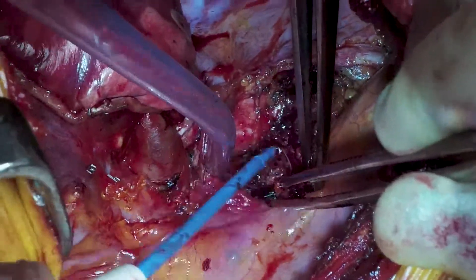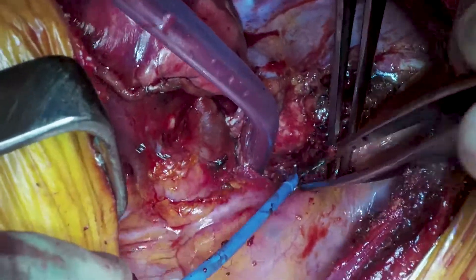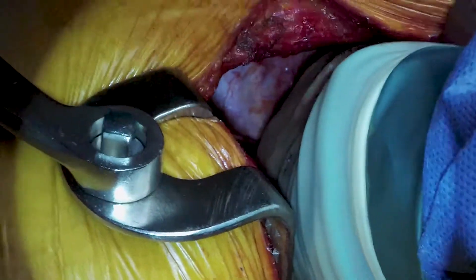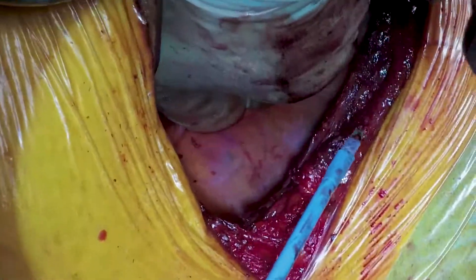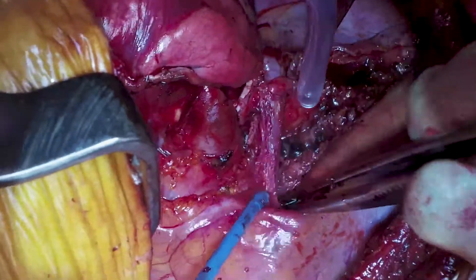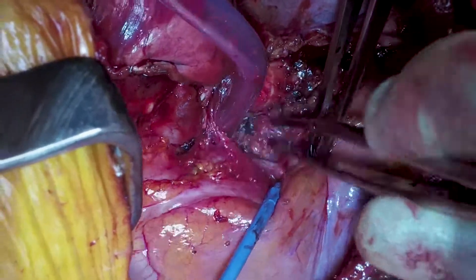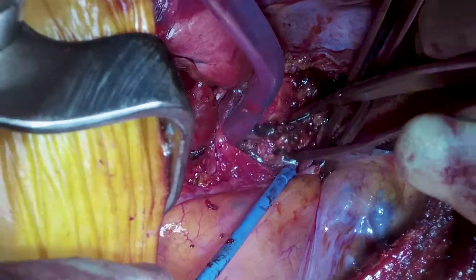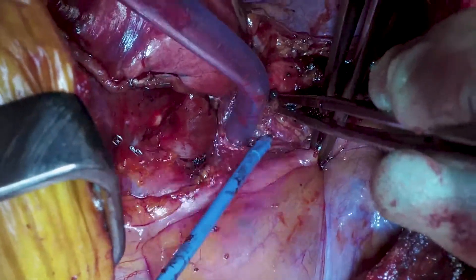This lady had an endobronchial ultrasound scan, then neoadjuvant chemotherapy, then mediastinoscopy, which led to the entire area being extremely adherent. We spent a lot of time getting it out, but this was the most important part of the operation because this was the previous area of positivity for the cancer. You could argue that removing these positive lymph nodes is more important than removing the cancer itself, as this is how it spreads through the thorax. Because histology was negative, she didn't need radiotherapy and has a high chance of clearing the cancer.